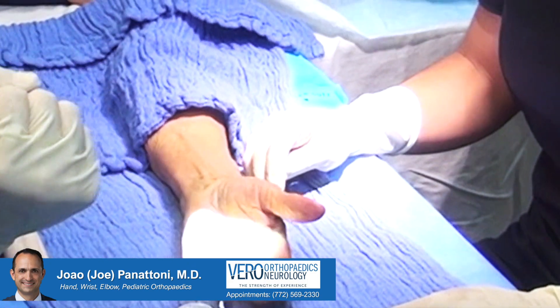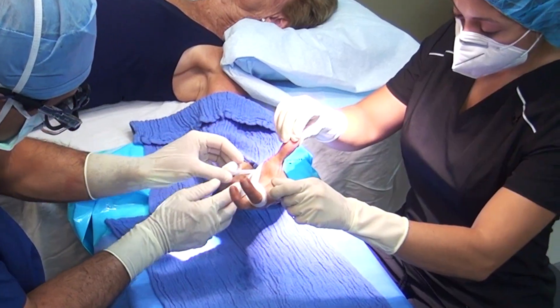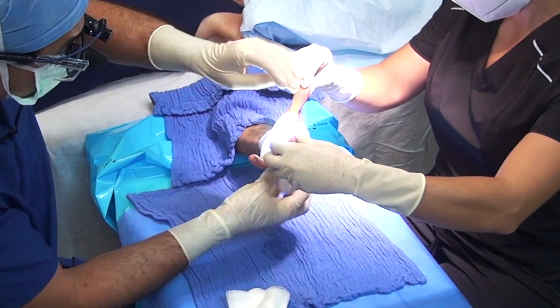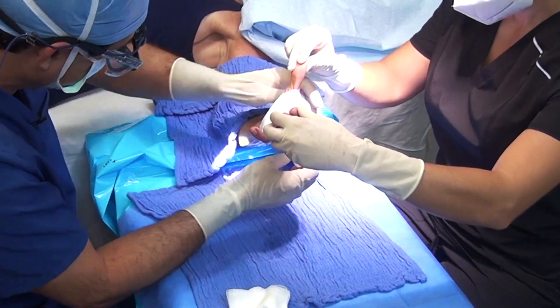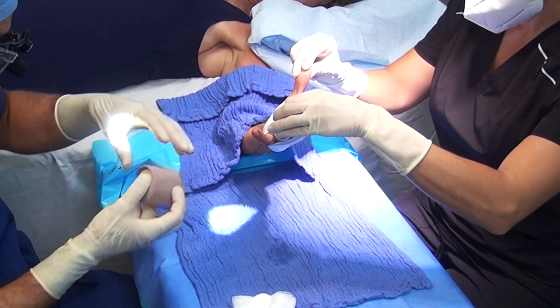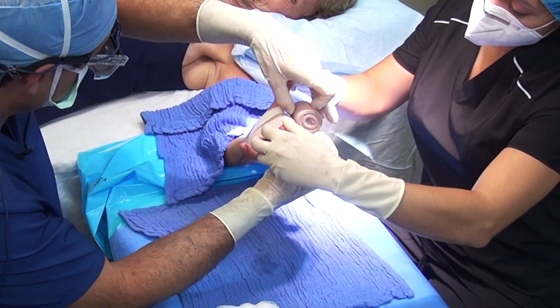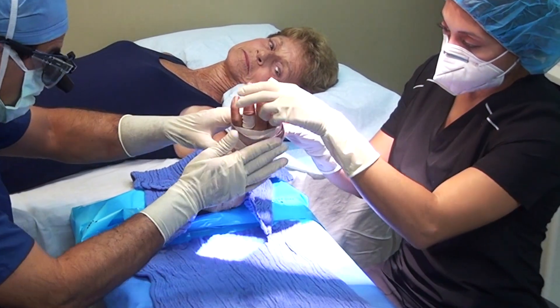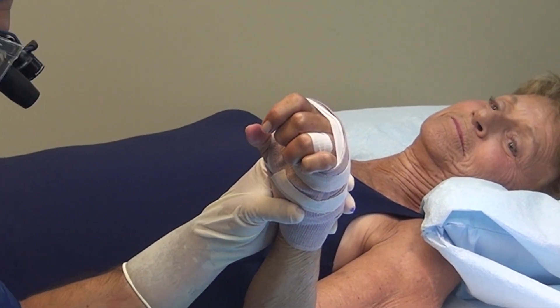Just three stitches in there this time. Try to make a fist — now open. Is it triggering? Not catching, right? It's okay to put some ice on it if you want, and hold it up — keep it elevated over your heart to prevent swelling. The first dressing I do a little bulky so there's no bleeding, but after the first couple of days you're just going to keep a band-aid on; that's enough.